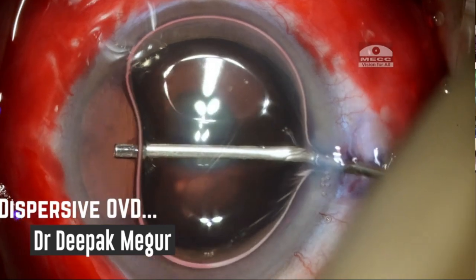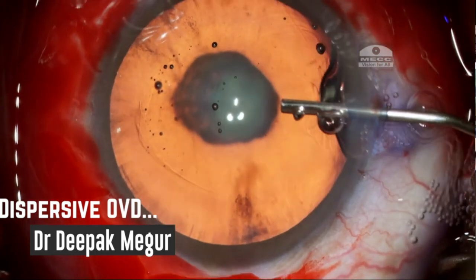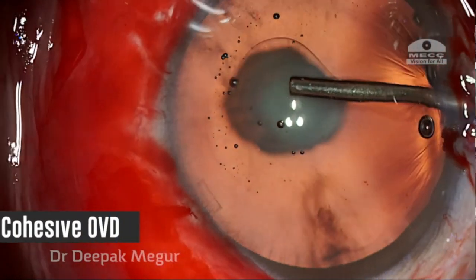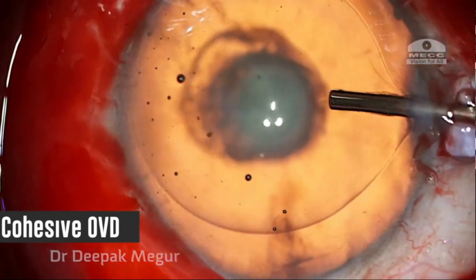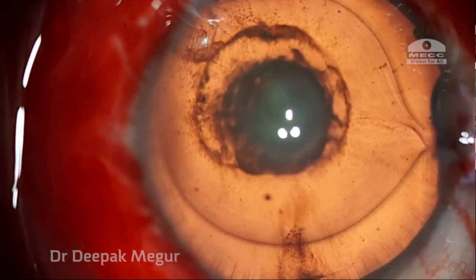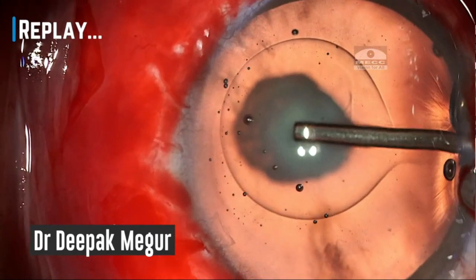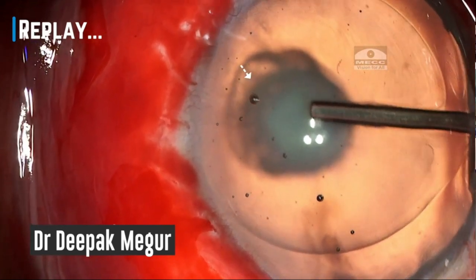So after making the two side port incisions, I stain the anterior capsule, and I'm using initially a dispersive OVD, followed by cohesive OVD for the classical soft shell technique. And as I'm introducing the OVD, I suddenly see something unusual happening here. When we go back and see the replay, the posterior plaque just expanded during the injection of the OVD.